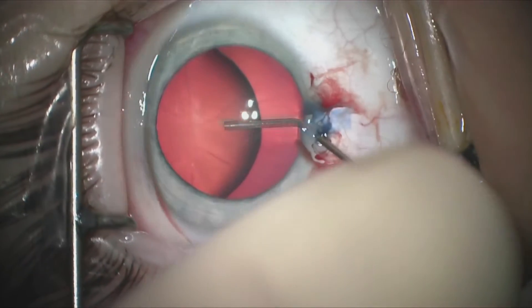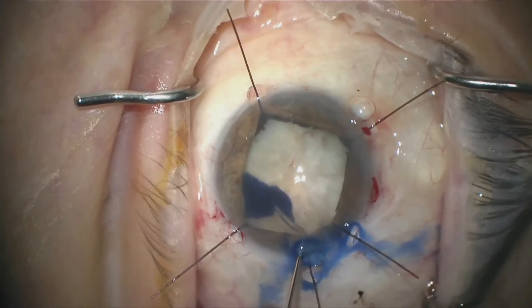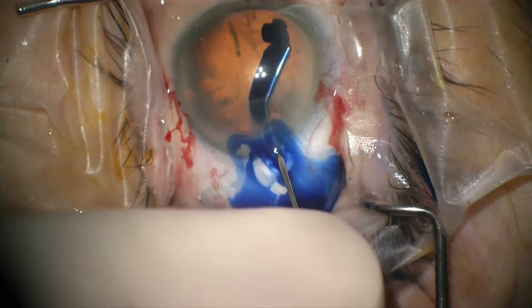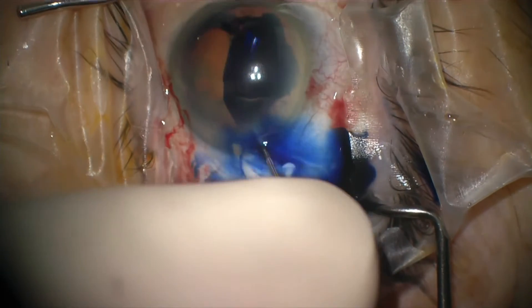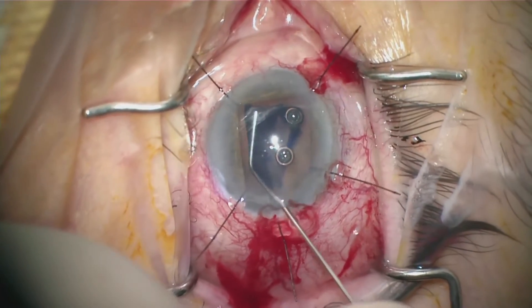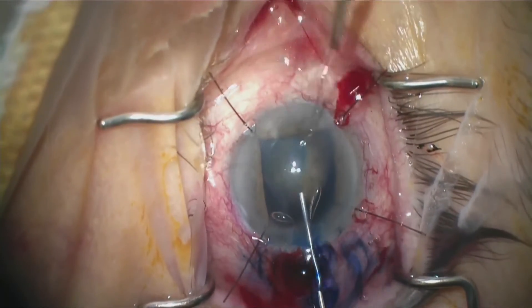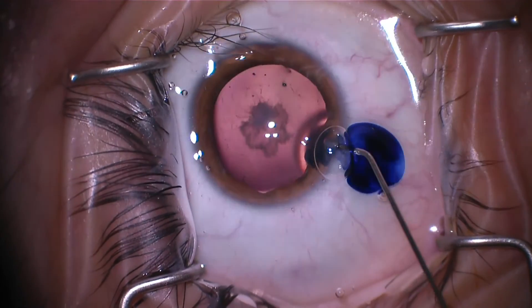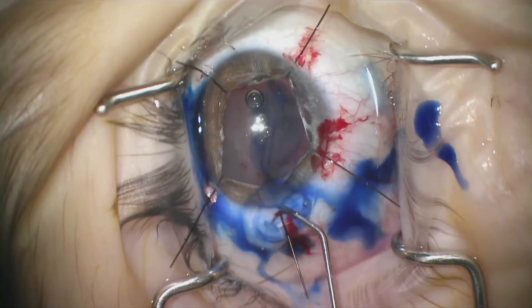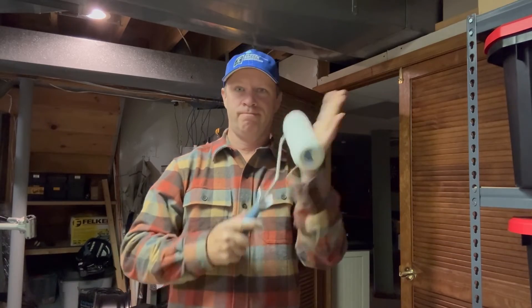I really like using the paint roller technique because you don't stain the vitreous. Here we're just using Tri-Pan Blue and painting the anterior capsule underneath OVD. It works with severe zonulopathy, white cataracts, and traumatic cataracts. You're not going to get nearly as much Tri-Pan Blue into the posterior segment, you're not going to lose your red reflex, and as that complex cataract comes out you'll be able to get your red reflex back to place the lens in the bag and remove cortical material. In my book, let's use the roll technique — that way I know I'm not going to make a complex case even more complex.